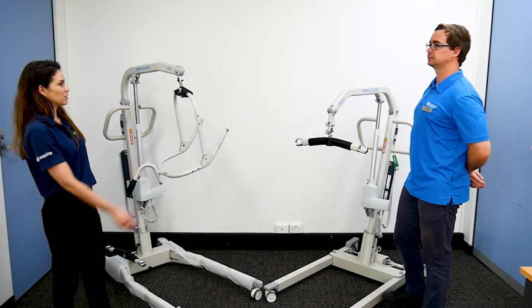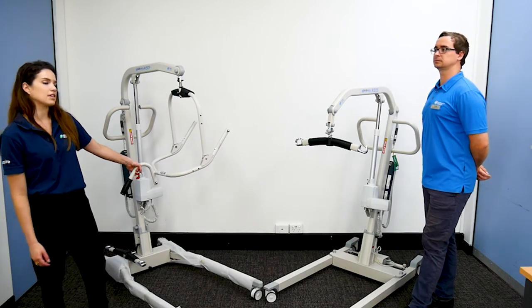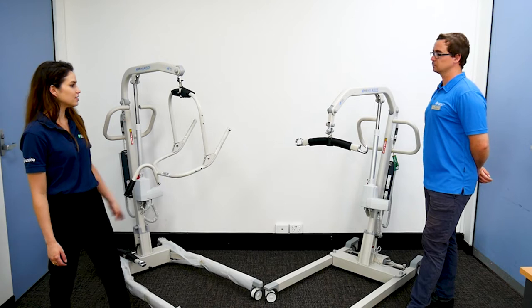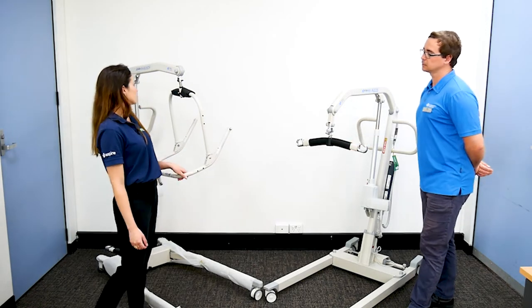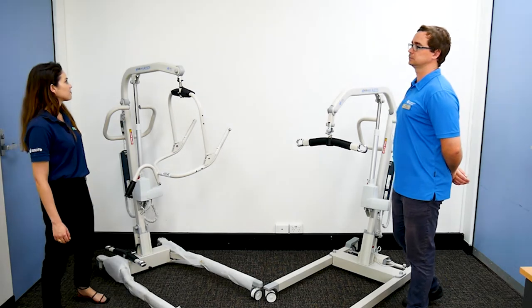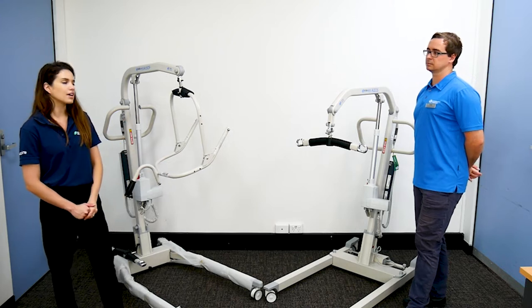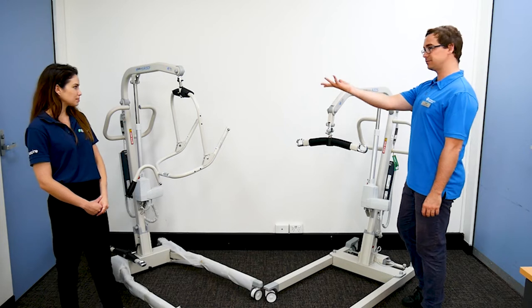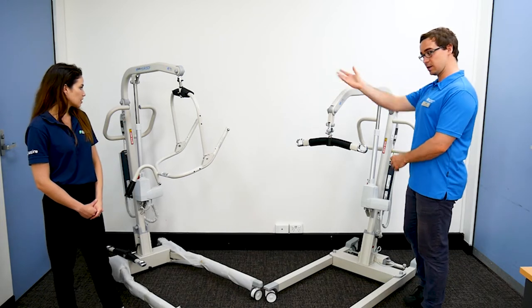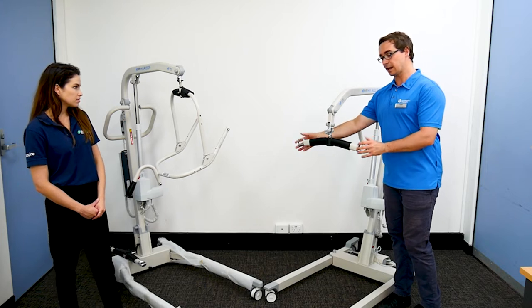Here we've got two full lifters. We've got one which is the A205 — it's an aluminium lifter with a safe working load of 205 kilos, and we've got the spreader bar attached to it. This one here is the A150F, so a safe working load of 150 kilos, and we've got a pivot frame on this one currently. This one can hold more weight; this one holds 55 kilos less — quite a lot less — and they have two different types of attachments for the sling.